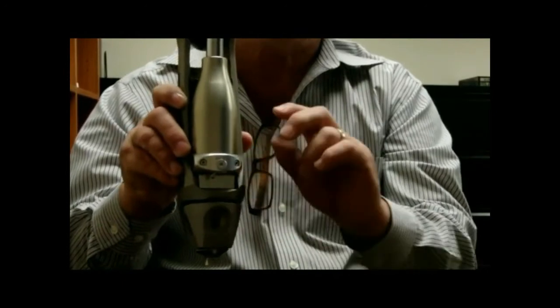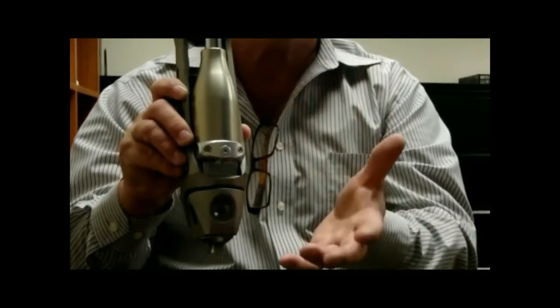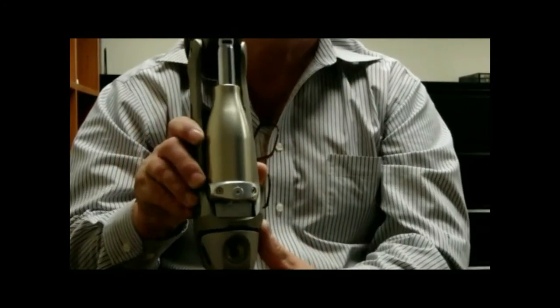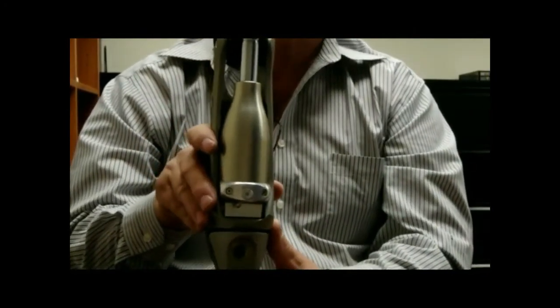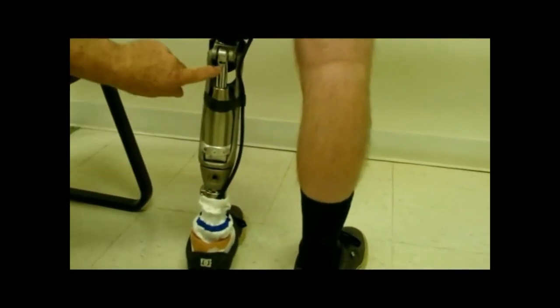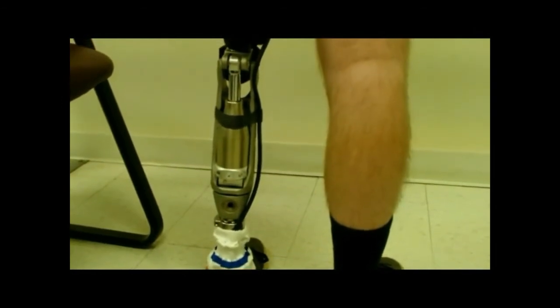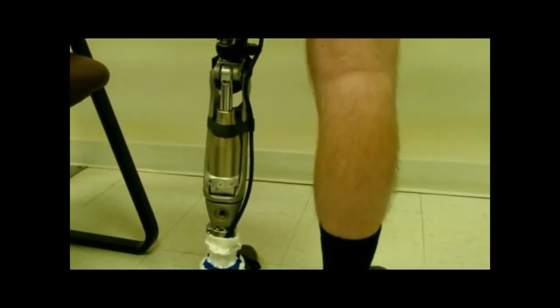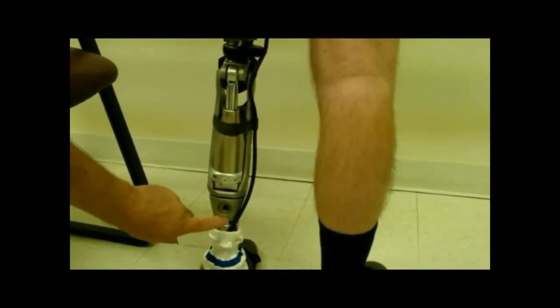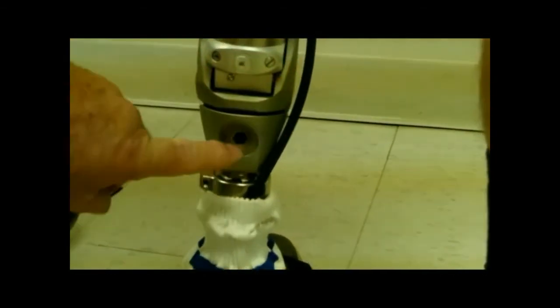This has a stop when you go counterclockwise, and it's very obvious, it's nice and smooth till you come to a stop. Do not power through that stop. You can break it. This is the very last thing you're going to adjust. Adjust the other first. If this will not do the job, then you come down here. If they're not having an easy time going into swing, it's the toe load that needs to be tuned. Not that, the toe load first.